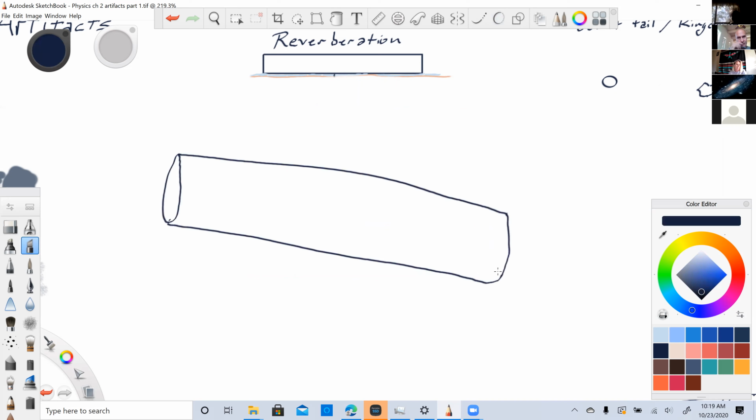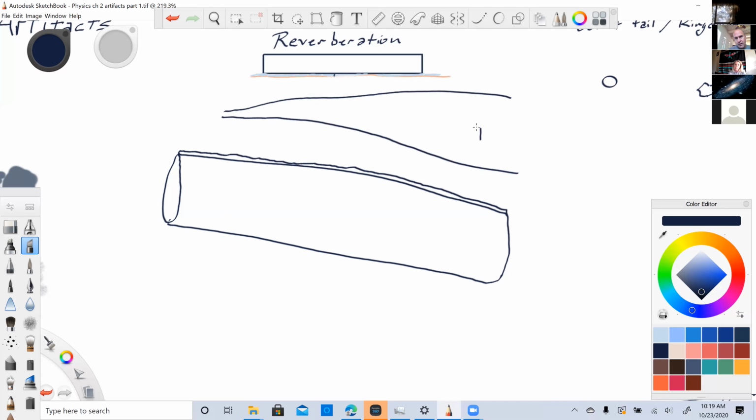I kind of have this at an angle here. Let's see, we have a very bright echogenic wall of the artery here. Now I'm going to use a layer. There's fascia, there's different muscles in here. So let's just say that's muscle, and then fascia. So that fascia can be seen more than once due to reverberation.